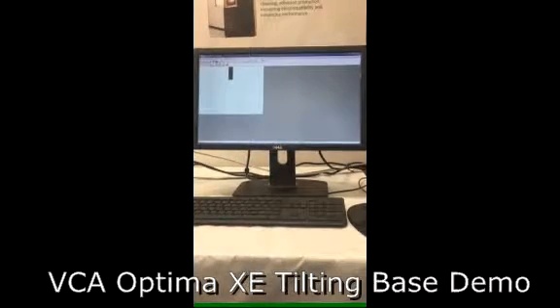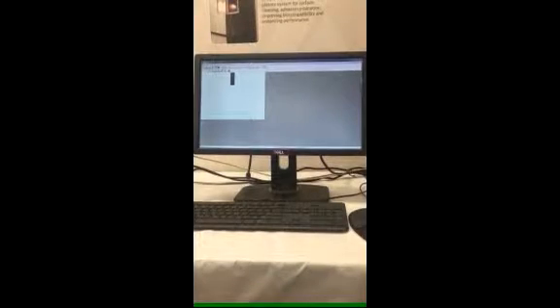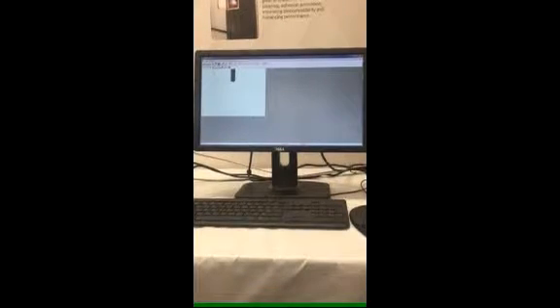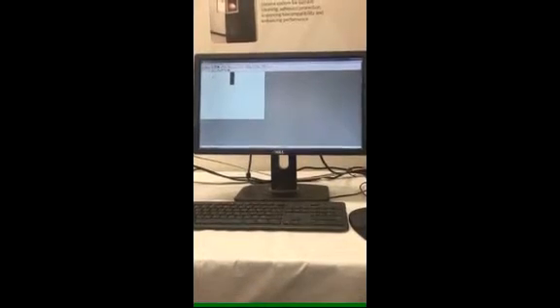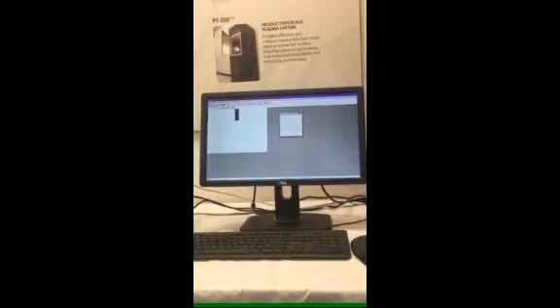In this video, we're going to show you how to perform a drop measurement using the tilting stage. First, you open the syringe control dialog box. From there, you type in one microliter or whatever amount you may want. After that, you hit go, which then dispenses the droplet.